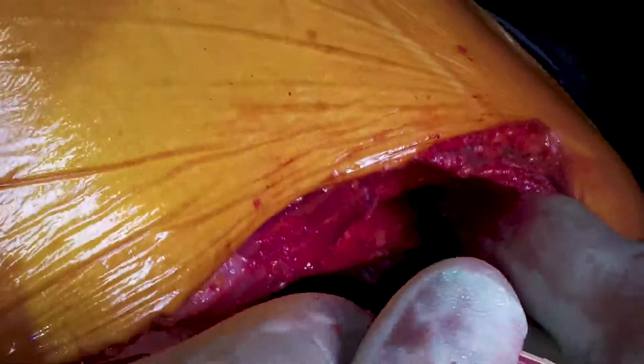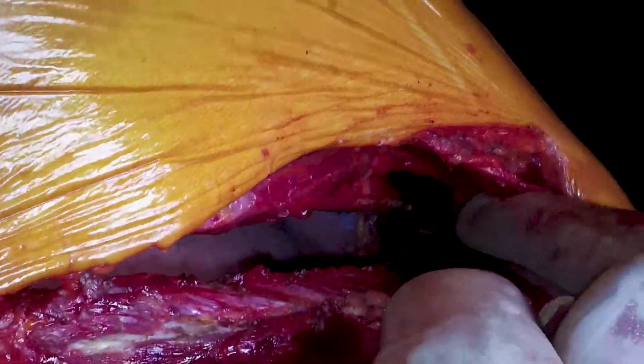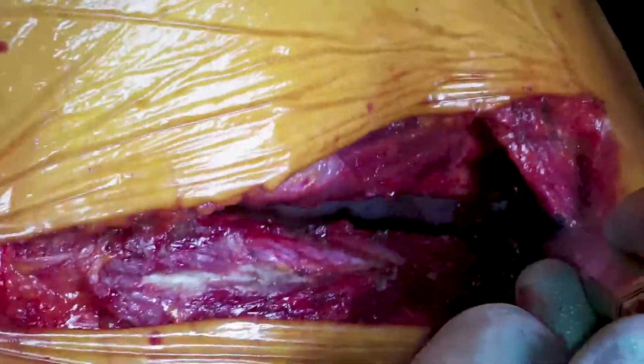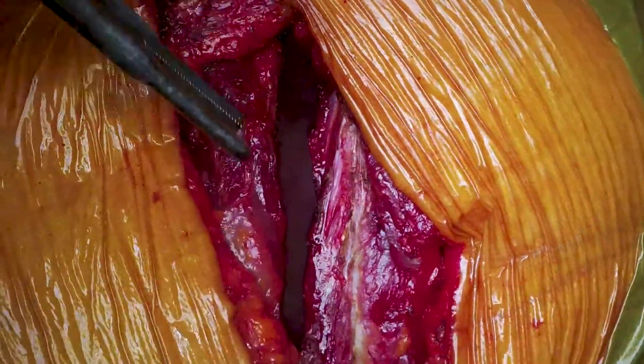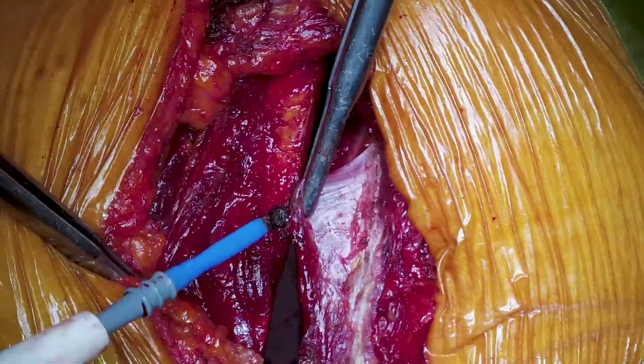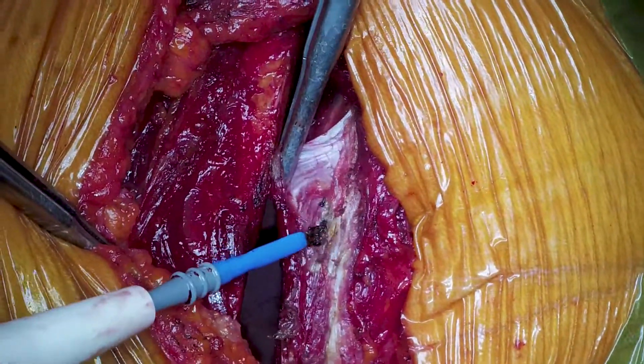Mr. Dunning is going as far back as possible with an angled periosteal elevator to divide the intercostal muscle off the sixth rib, leaving a bit of pleura intact at the back. Another benefit of keeping the pleura intact at this point is that after the operation we tend to place an intrapleural catheter for post-operative pain management.